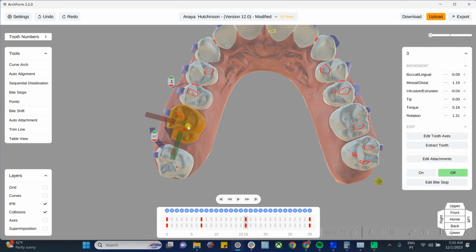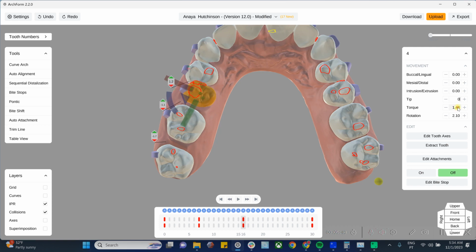Okay, so we'll get back to the 6 in the meantime after we've set everything else to 0. So you're going to watch our number of steps change a lot during this process. We'll just verify everything at the end.